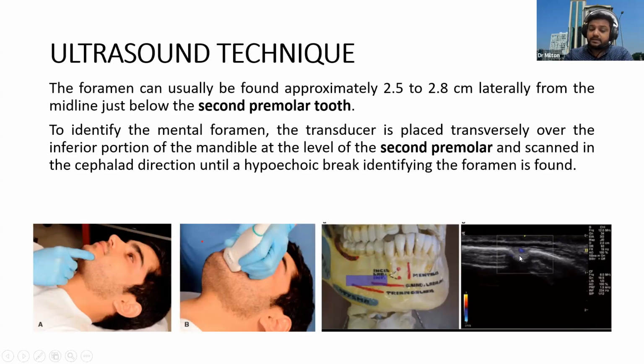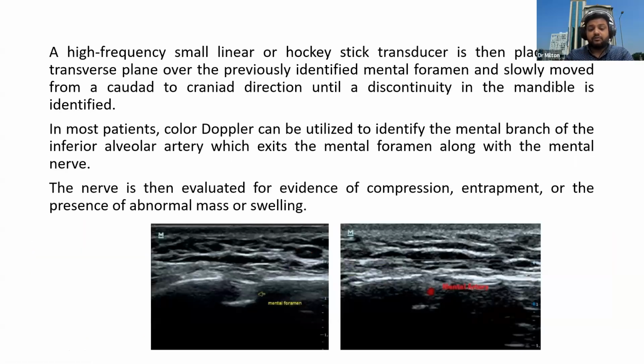So here, the same thing: it is better to avoid injuring the blood vessels, because there are very important blood vessels that supply this area, so it is better to avoid these.